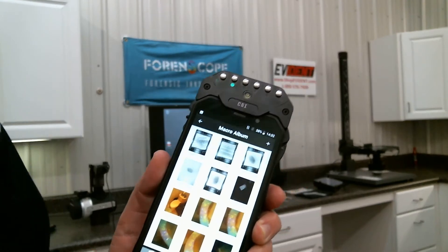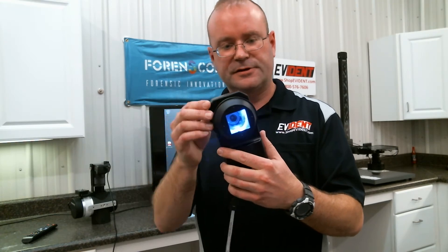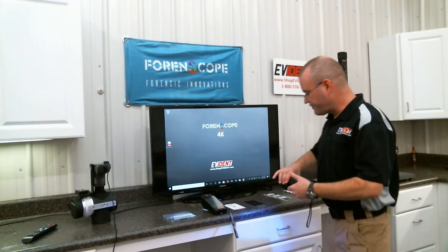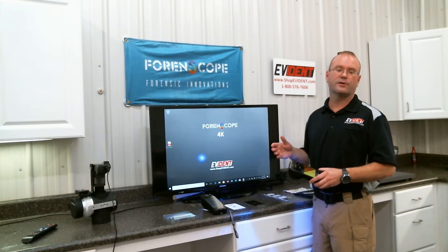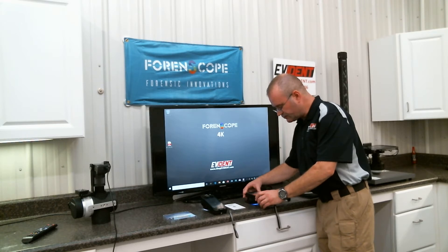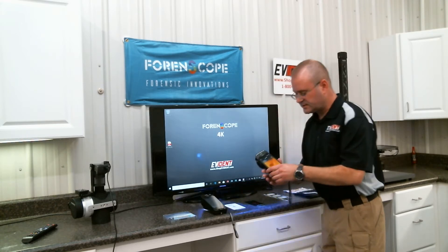With the addition of the blue and green lights, we've got the capability to switch over to blue. Here's my filter wheel — I'm going to rotate this around to orange. Now it's like I have my orange goggles on, like I have my orange filter on my camera. I have a fingerprint here that's processed with fluorescent powder. This phone will also work with fluorescent dye stains, DFO. I'm going to set the device right over the print, tap the screen to focus and take a picture. It's that quick.